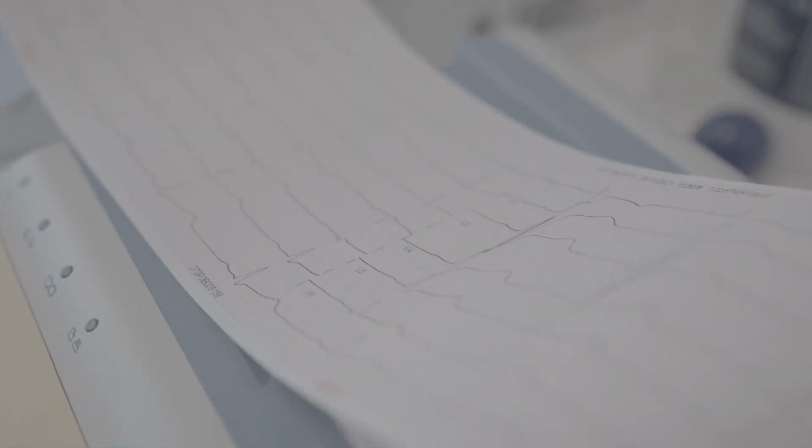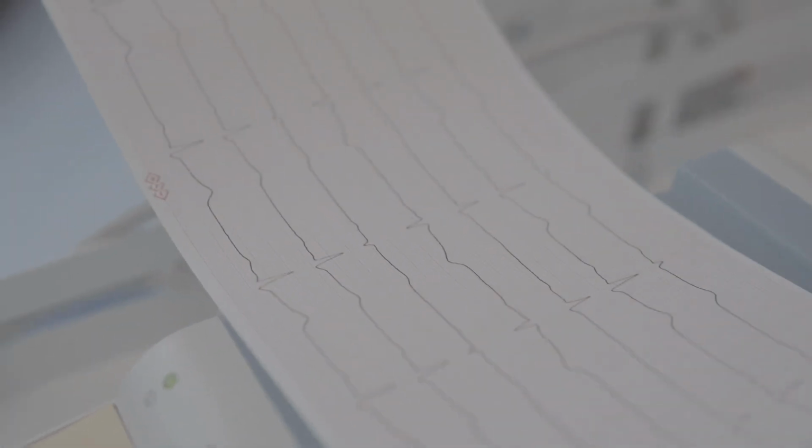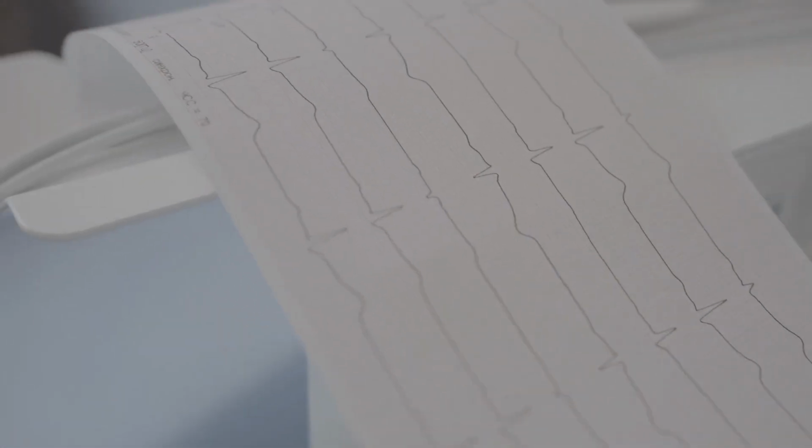The next is bioelectrical sensors. Sensors that measure electrical signals from the body, such as ECG and EEG sensors. The next will be chemical sensors. Sensors that detect and quantify specific chemicals or biomarkers in bodily fluid.